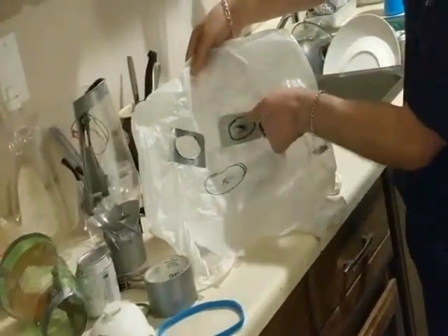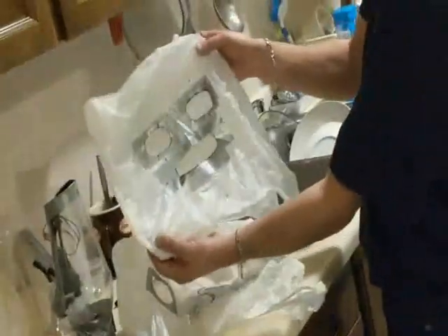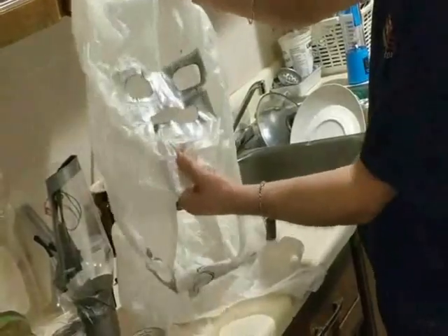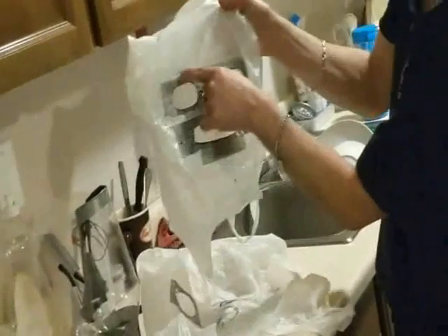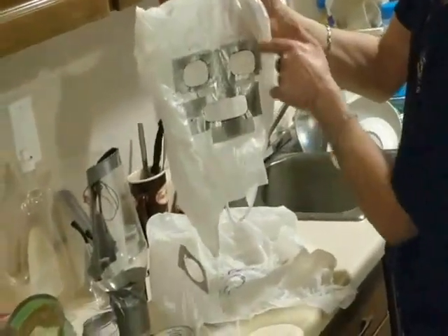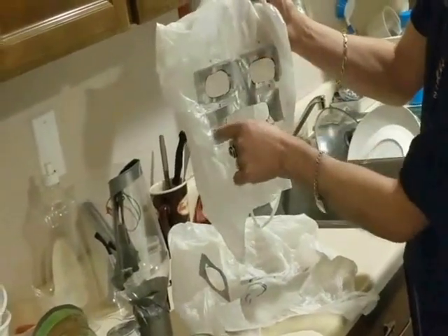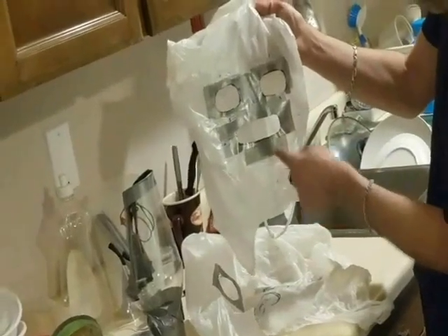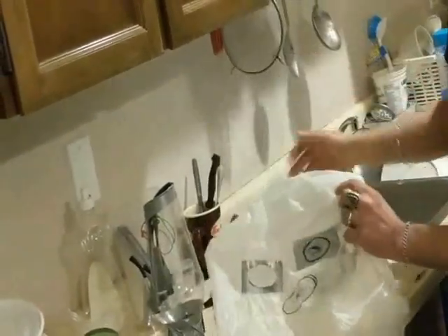You're going to repeat the same process on this eye and this mouth, and it's going to turn out and look like that. And believe me, if you really want to go into big detail, you can put little marks right here, that way you'll know that's the center line. This is the center of the mouth, center on that side, left and right, and this is the little marker here, center. You'll know exactly where everything is. I'm just rushing over here, but this is how you'll do that.